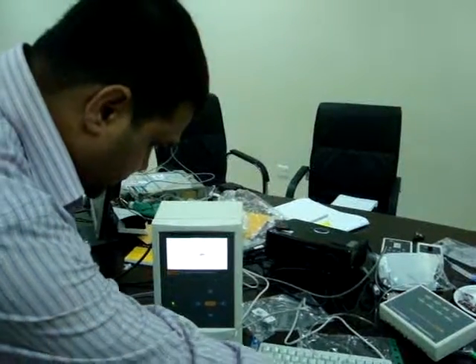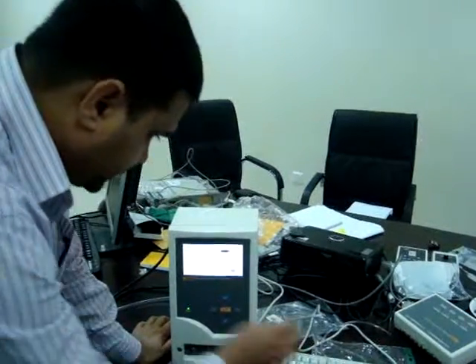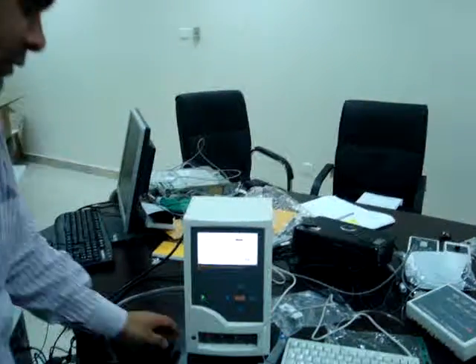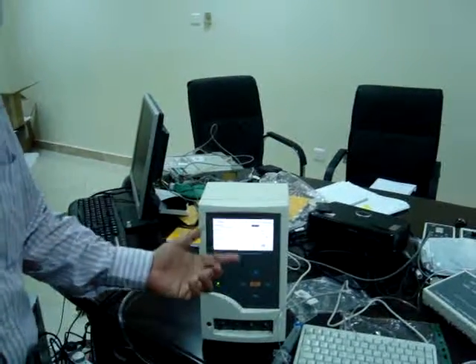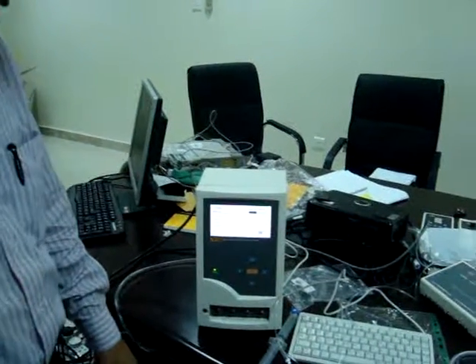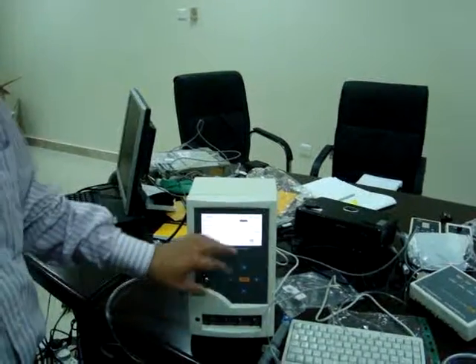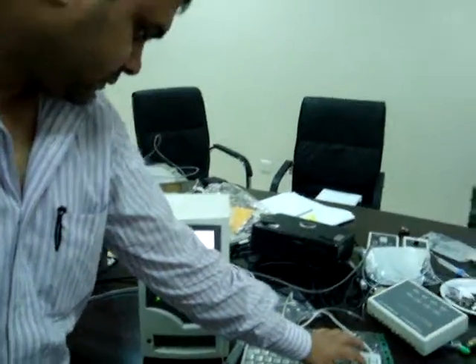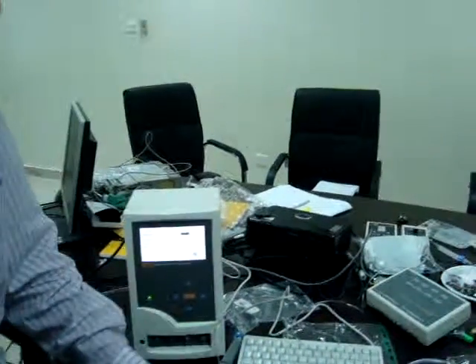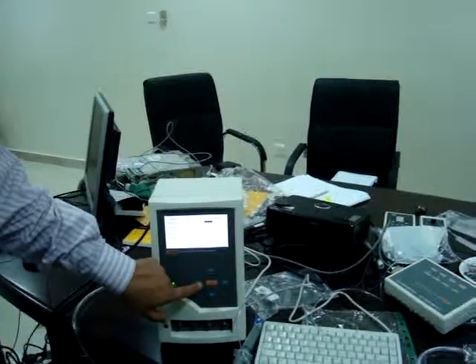Okay, then you can set your bolus parameters. How many ml bolus you want to give, total volume how much, bolus volume how much, loading time and dose ml. Again, all these things you can set using this keyboard, or you can use the arrow keys.